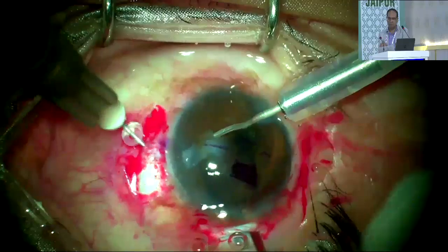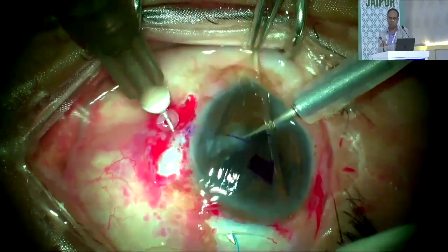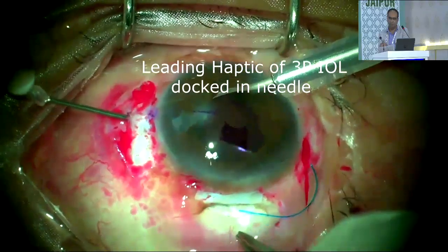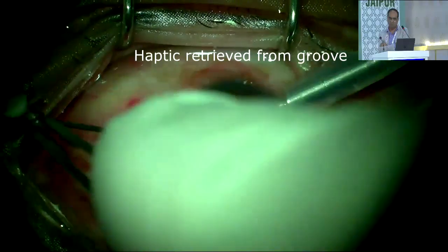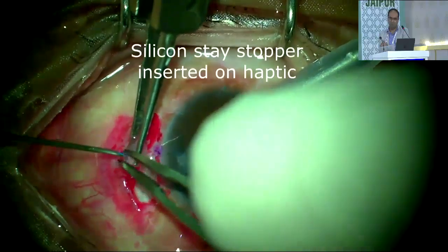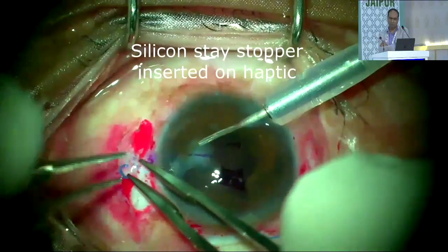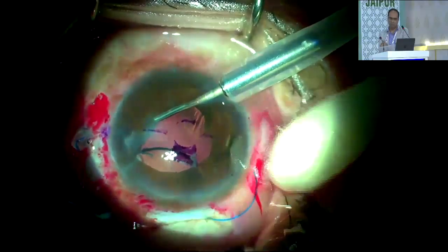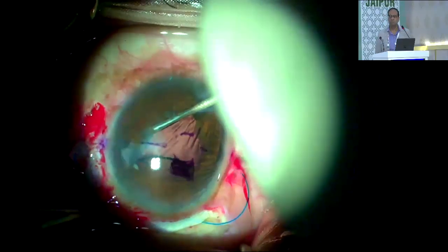The leading haptic of the 3-piece rigid IOL is docked into the needle and retrieved from the scleral groove. To prevent the haptic from slipping back, a silicone stay stopper is placed over it. The trailing haptic is similarly retrieved from the right scleral groove.